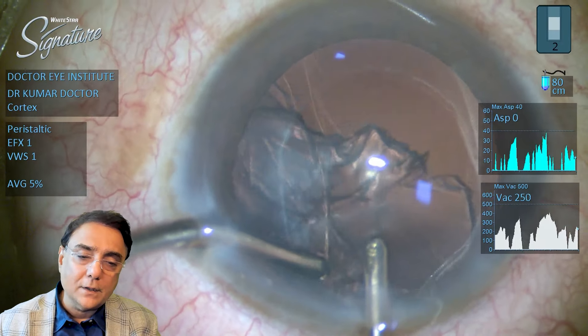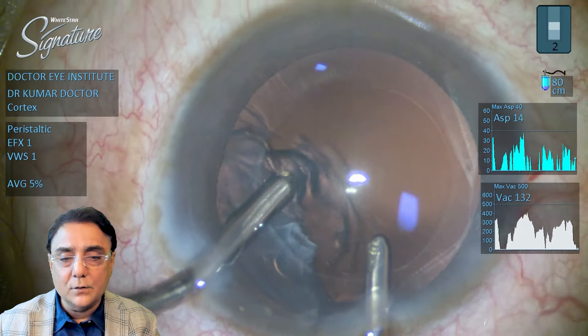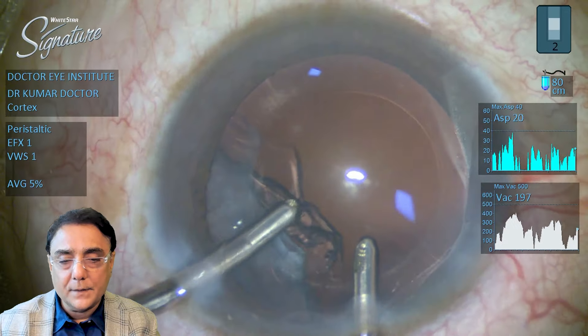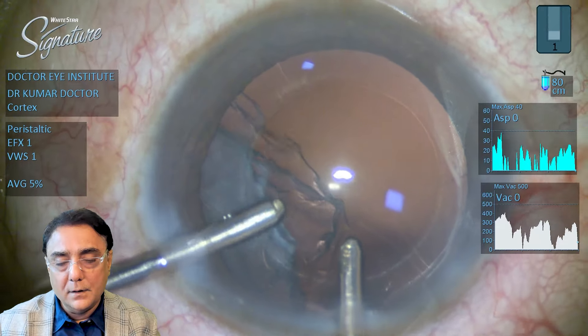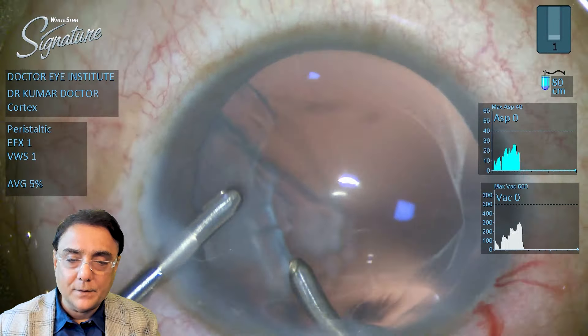Once three-fourths of the cortical matter is removed, one can go ahead and do a change of hands. Once the change of hands is done, just go ahead and aspirate the rest of the cortex.